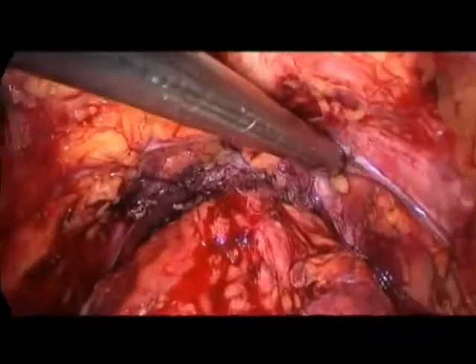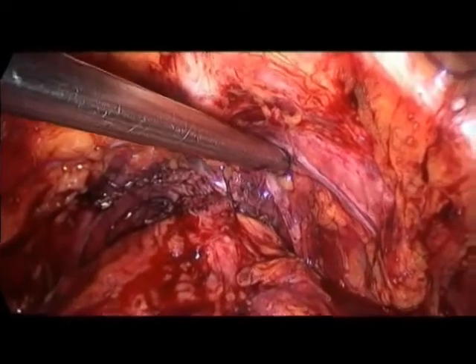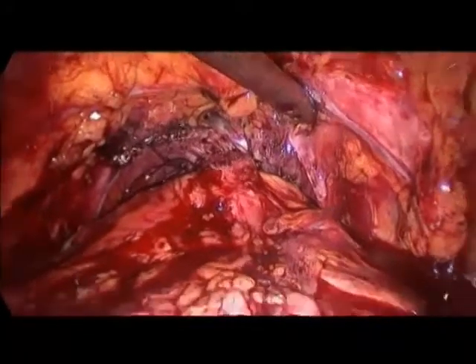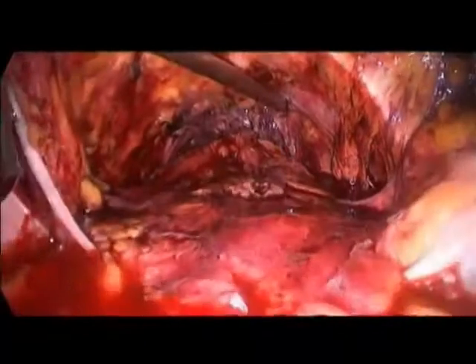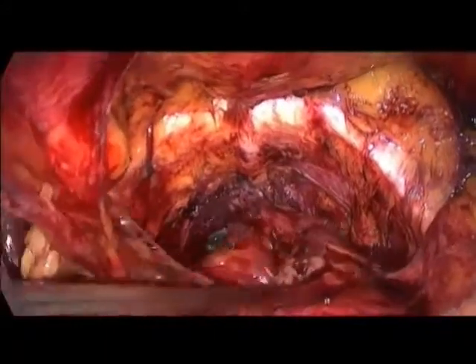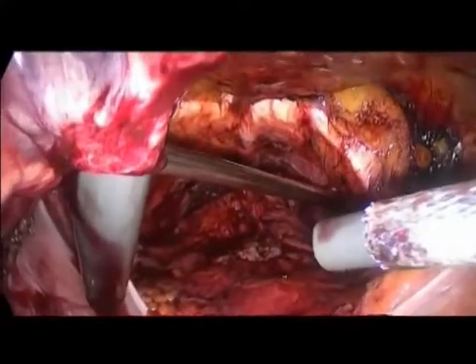This sounds much better. And we will now irrigate with the suction device to have a large volume. Forceps. Thank you. Usually we have a bladder syringe on the table at the end of the procedure to wash out the bladder. Move back. Is it irrigating? Don't see it. Where is it? It's not in the proper space. It's behind. Let's have a look. Move it away. Did you deflate?